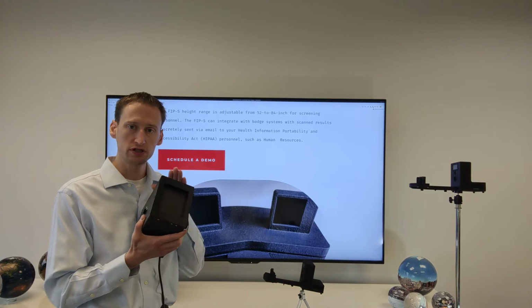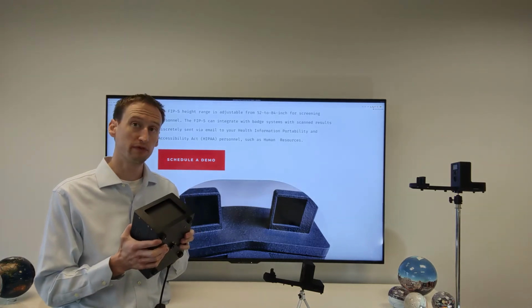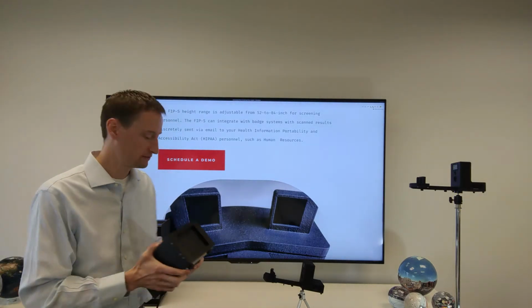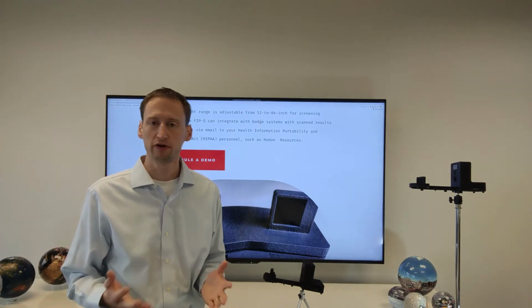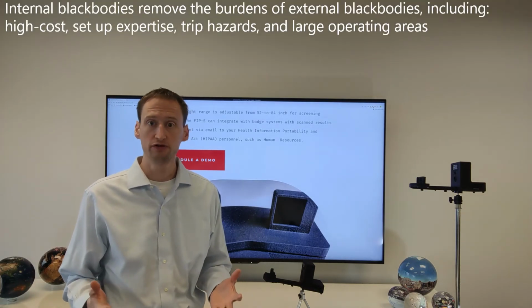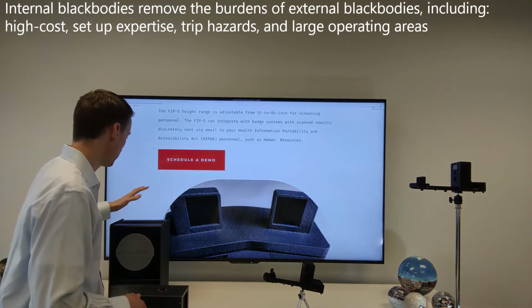But paired with a standard brightness generating black body device, it can be as accurate as plus or minus 0.5 degrees Fahrenheit. Now you're talking real safety. You can detect real fevers. The challenge with these black body systems, however, is that they add a lot to the operating footprint. They add a lot to the burden of what the operator has to do to ensure it's still working. And they're also costly and somewhat fragile.